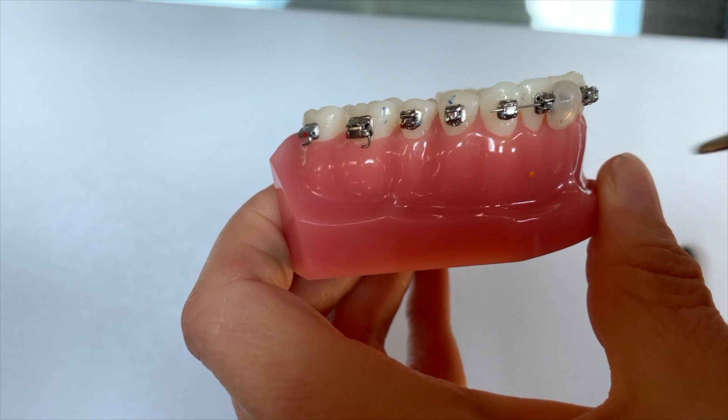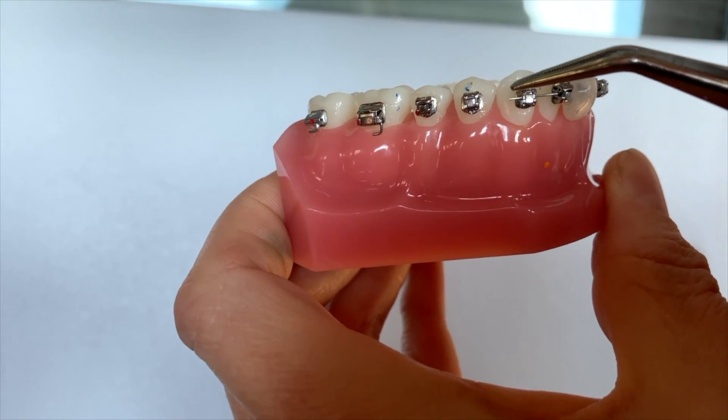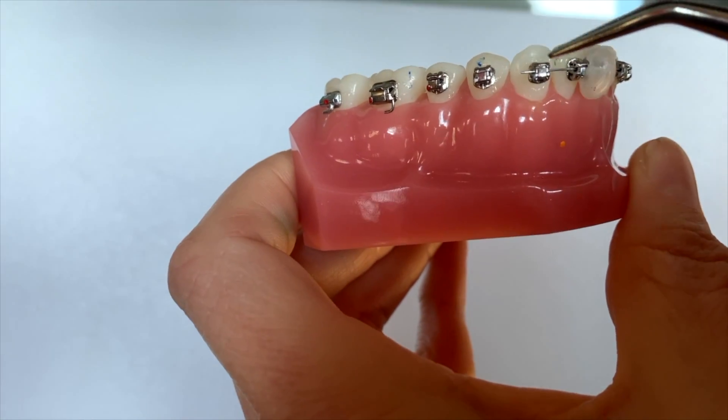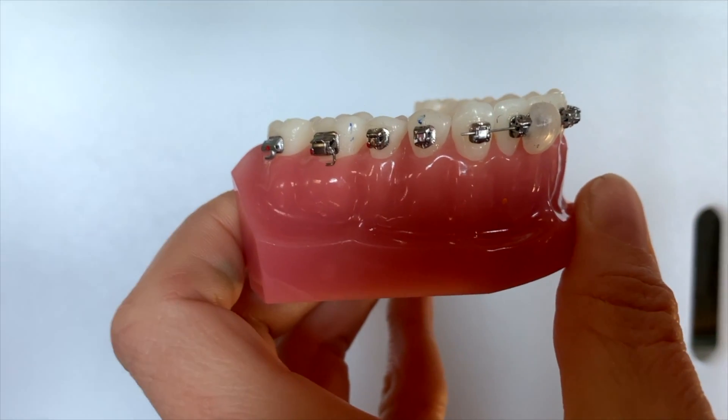If you do have a little pokey wire up here that starts to hurt your cheek a little bit, absolutely use some of the wax I showed you earlier how to use. Just put that right around there and that should keep you very comfortable.